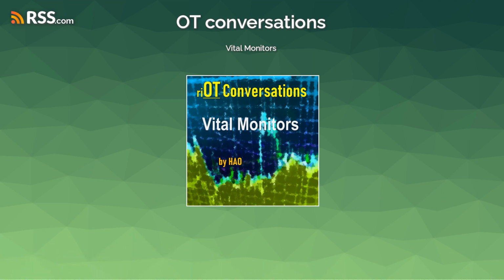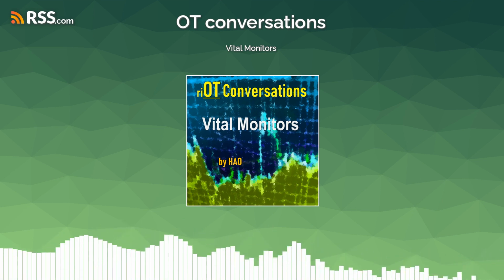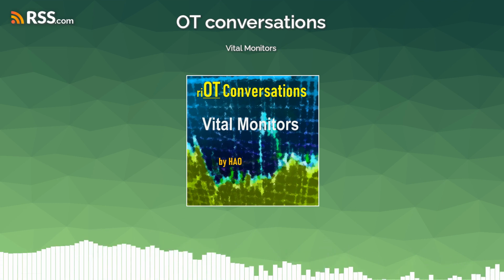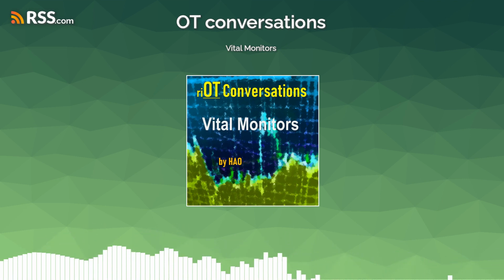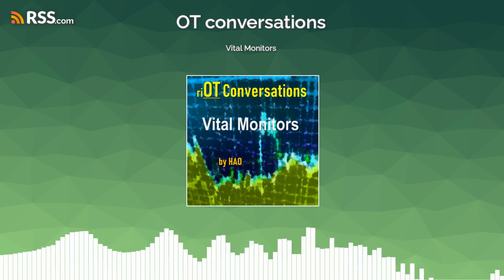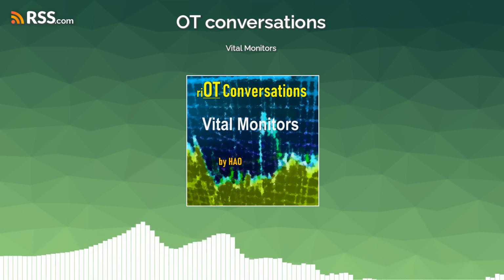Many of the units, sometimes the majority of them, have some kind of auditory and visual signals that can be activated, and they can cause alarms every time you move the patient. So it'll be helpful for you as a clinician to be familiar with whatever sounds they are producing.